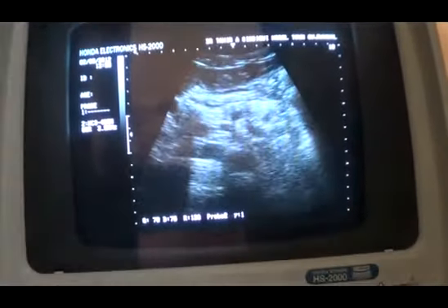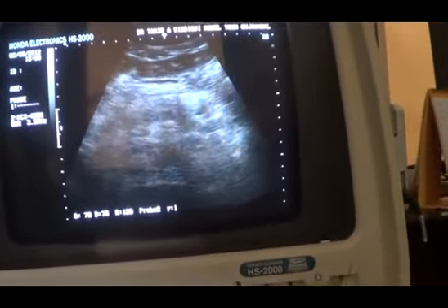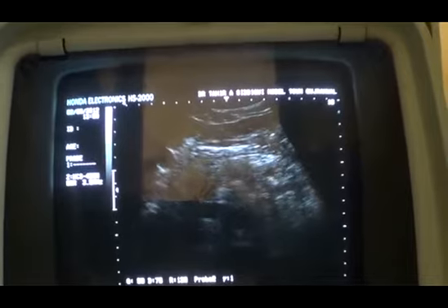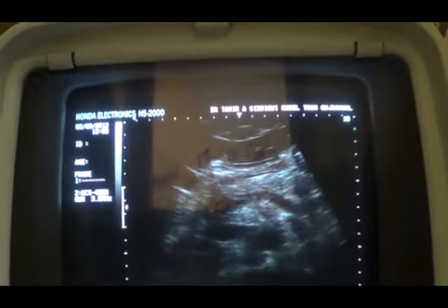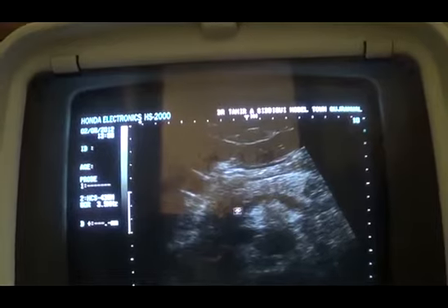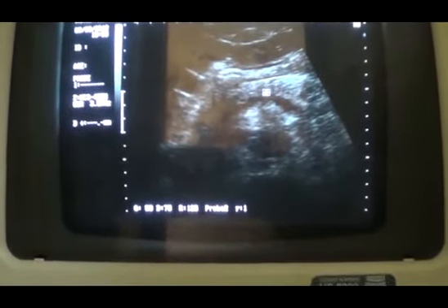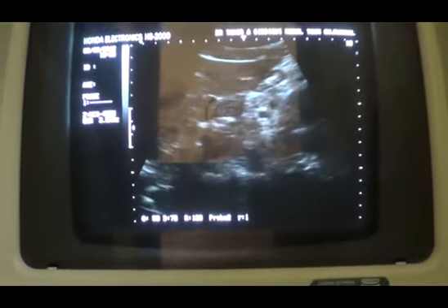Along with its landmark. Because the liver and the other viscera come downwards, it becomes easy to see the pancreas. So the pancreas is normal. This is the splenic vein, the landmark for the pancreas. This is the superior mesenteric vein. This is the aorta in transverse section, and this white band of tissue is the pancreas. We do not see any mass relating to the pancreas in transverse or longitudinal section.